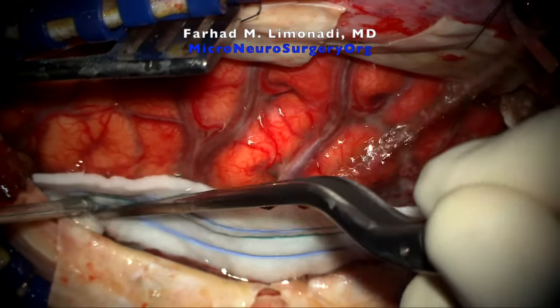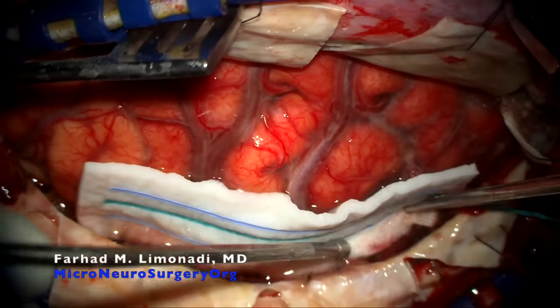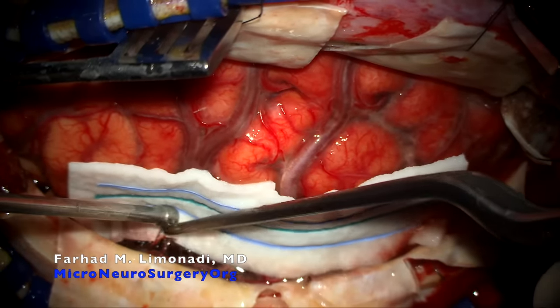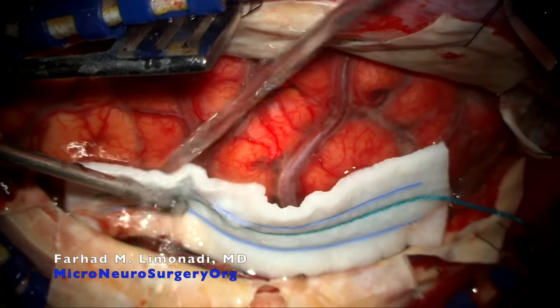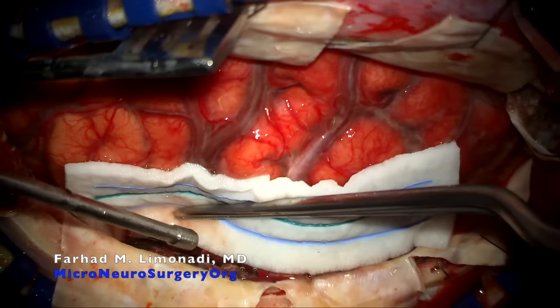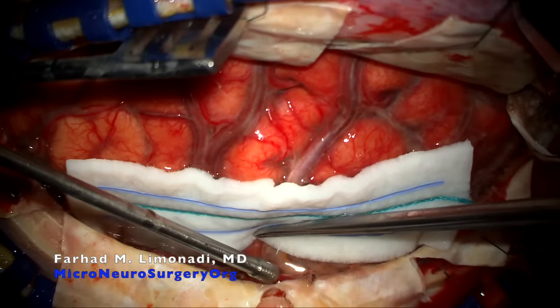Wet cottonoid patties are used to protect the brain in form of a barrier between brain and surgical instruments where contact is inevitable. They are gently placed over and not dragged on the brain. They spread the force of instruments, resulting in less pressure on brain during retractions.